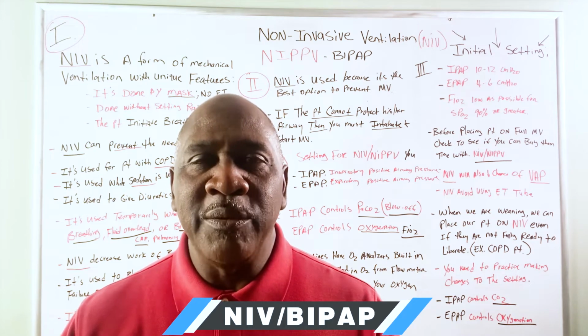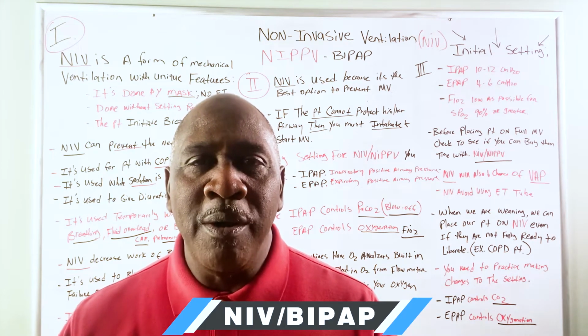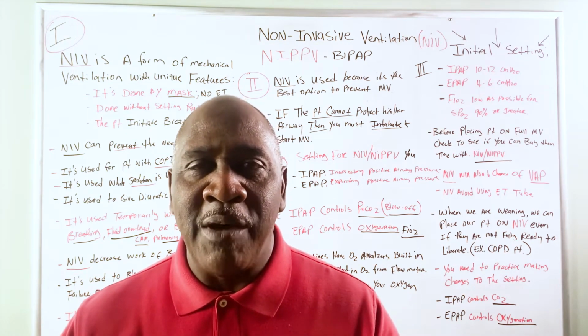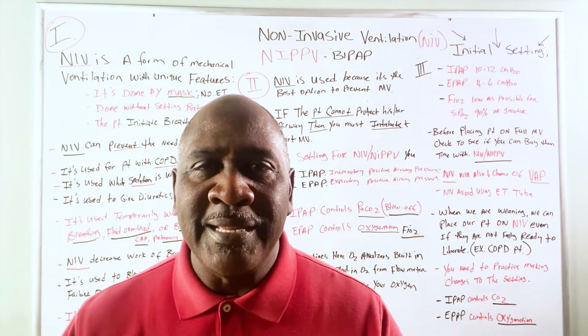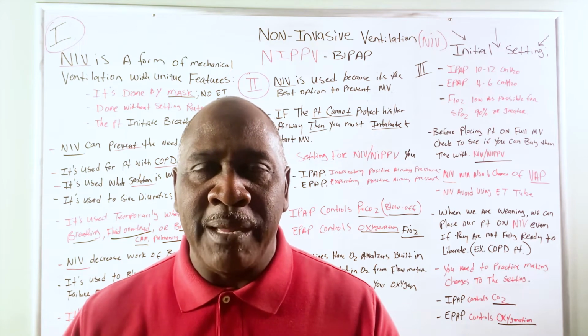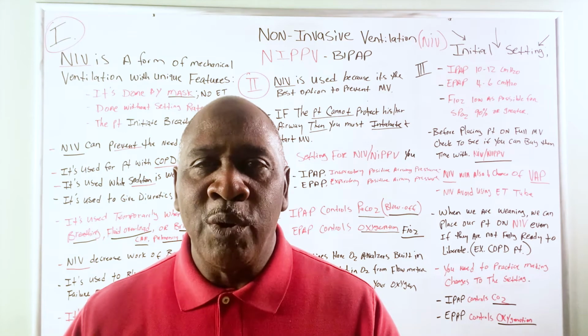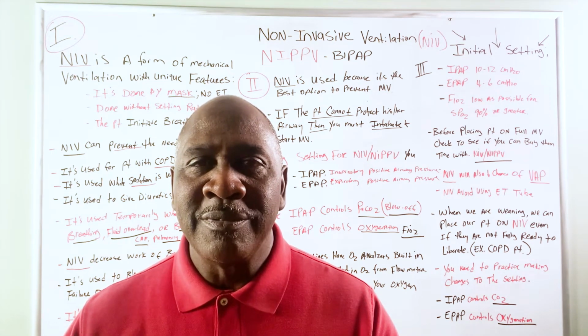Now, tonight we are talking about non-invasive ventilation or BiPAP. And I can't stress to you enough how important this subject is, because you must know the ins and outs when it comes to NIV and BiPAP. It is the one thing that can save your patient from going on full mechanical ventilation. Are you ready to go?